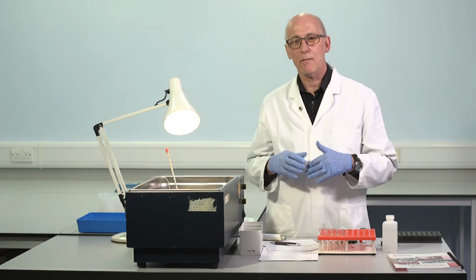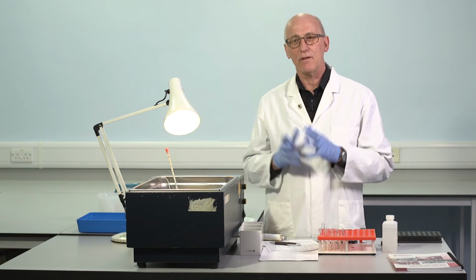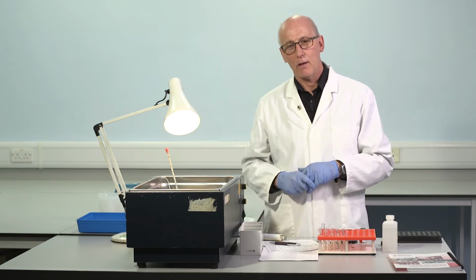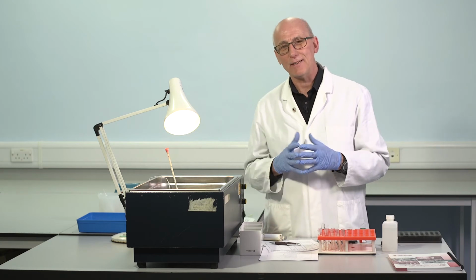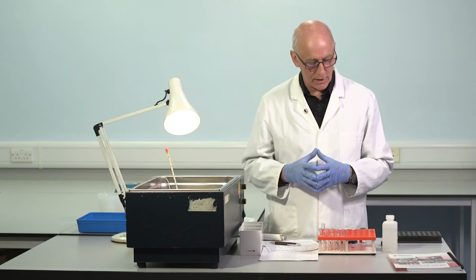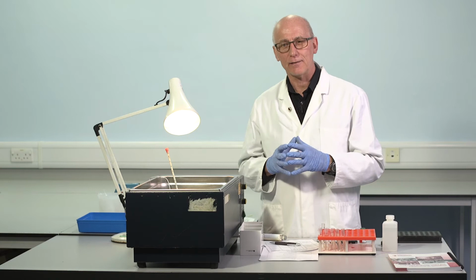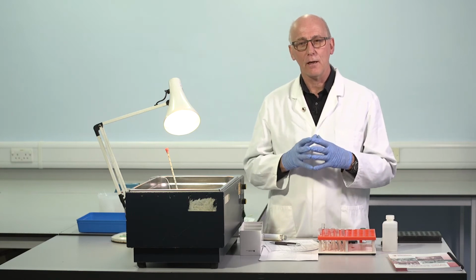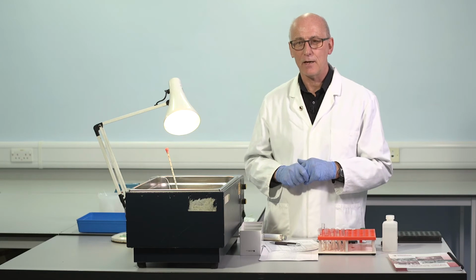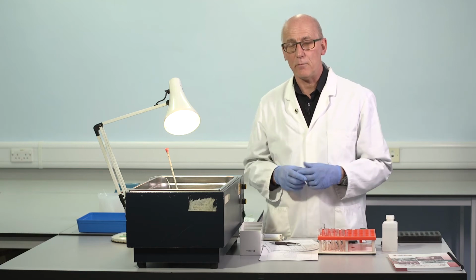And we sent them the same test sample for factor VIII assays. And when they sent the results back, so they all assayed the same control material, we divided the results according to whether the centre did 3 dilutions, 2 dilutions, single dilution. The average result was very similar, but the variability was significantly worse in the centres doing a single test dilution. Actually, the CV, the coefficient of variation of results in different centres, was fairly close to 100%. It was enormously variable. Single centre, single test dilution. If you looked at the centres who did 2 test dilutions, there was a much better precision, much closer agreement between results in different centres, and not surprisingly, I think, the best agreement occurred in those centres who did 3 test dilutions. So, important for precision.